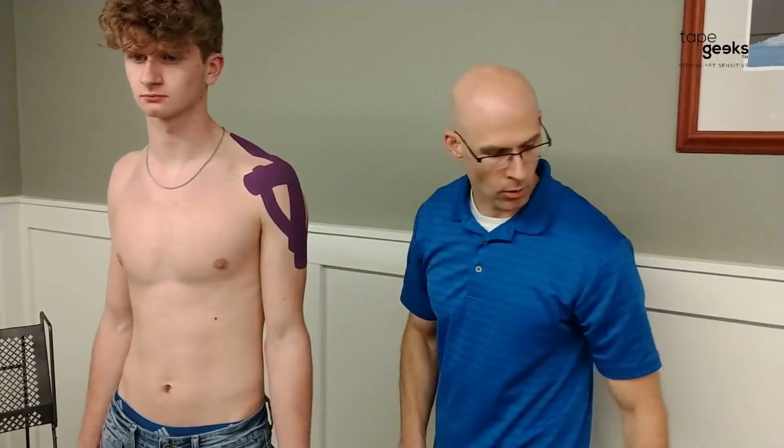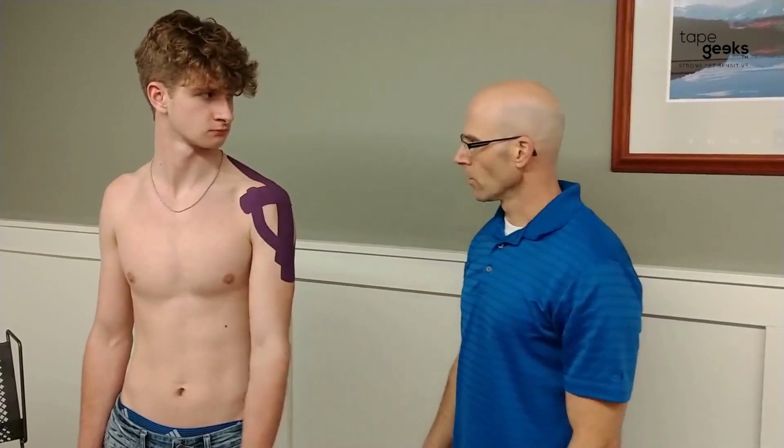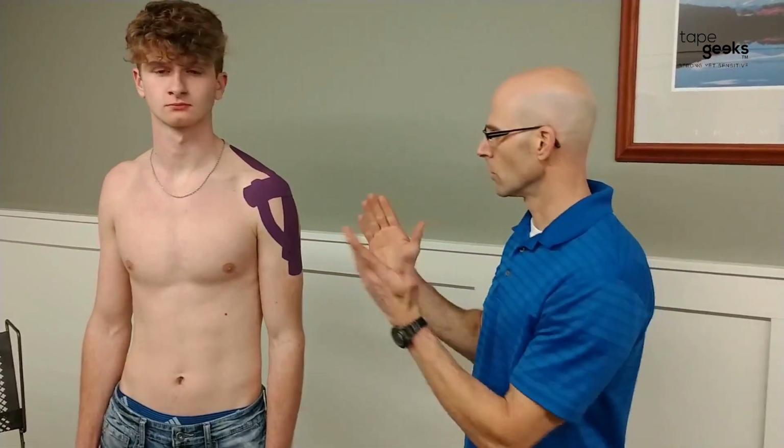All right. So then you can always retest and see if raising that arm up helps reduce the symptoms that they're originally having. And notice that's the deltoid tape job. Again, you could use your hands to determine which direction best applies to help reduce the symptoms.